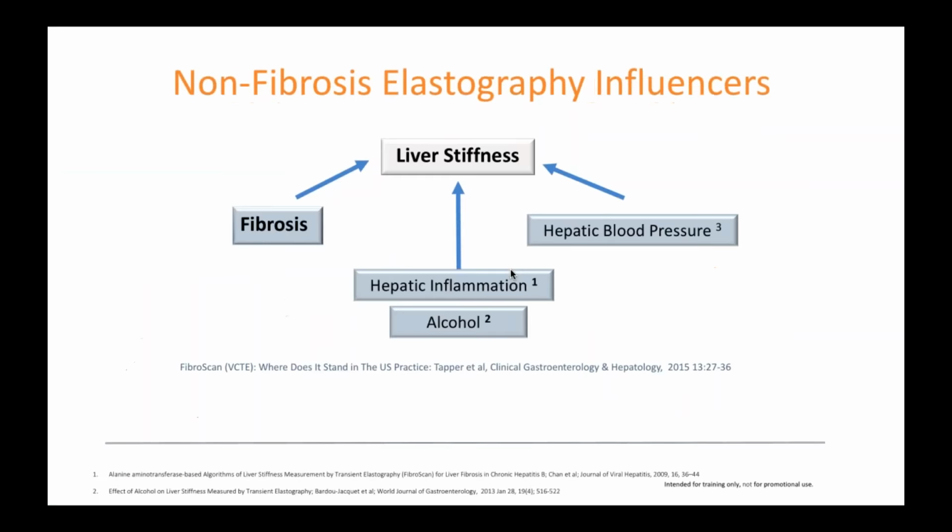Moving along, let's see here. So Jerry, I think you mentioned this as part of the AGA guidelines, but could you speak a little bit about how alcohol can potentially affect stiffness? How is it perhaps affecting the stiffness measurement?